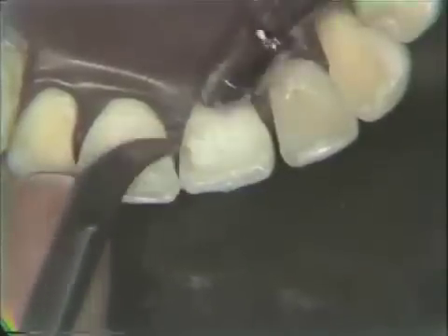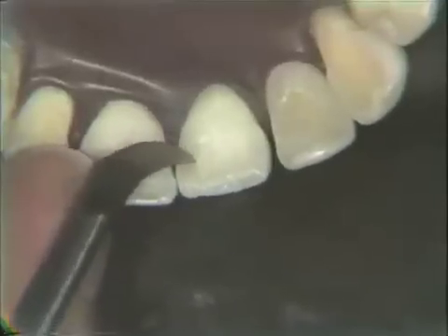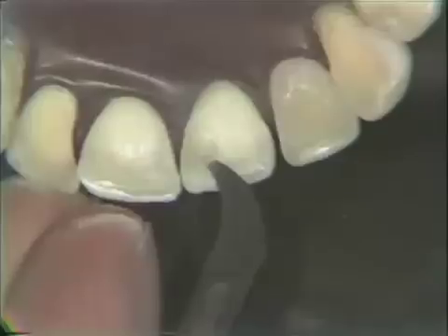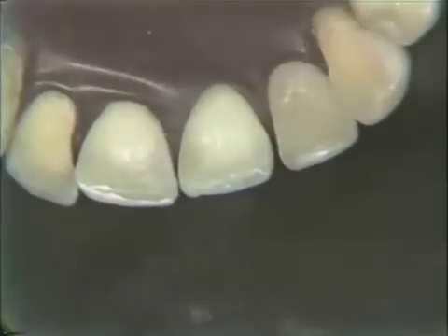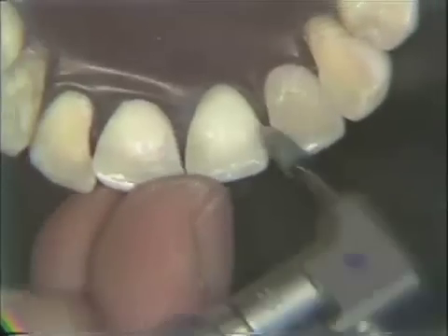This is the 12 blade that we mentioned before. A little dryness shows you just where that is. Now, this instrument is used to score the material away from the margin. Do not try to score this right at the margin, or you will have a void in your margin. And then after scoring, it is lifted out, as you could see.